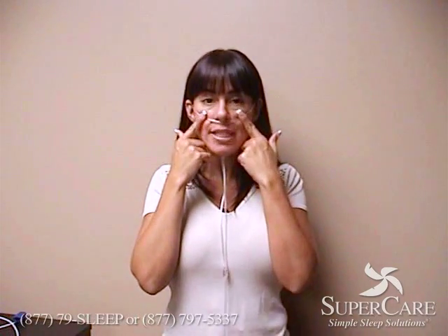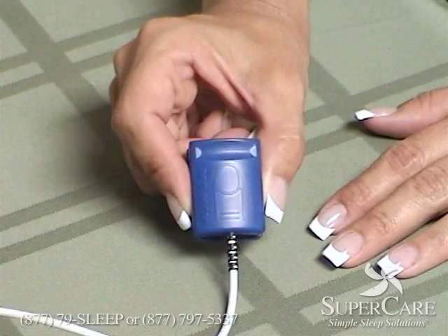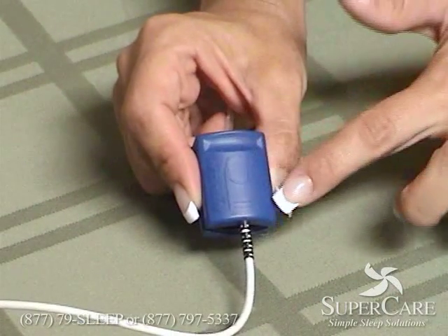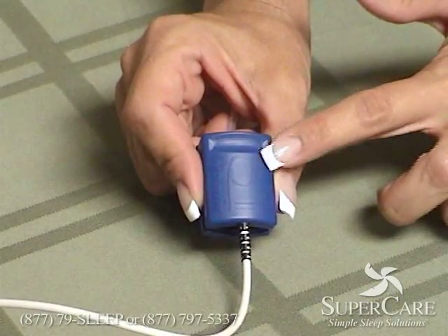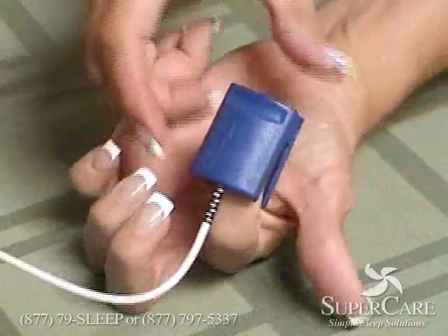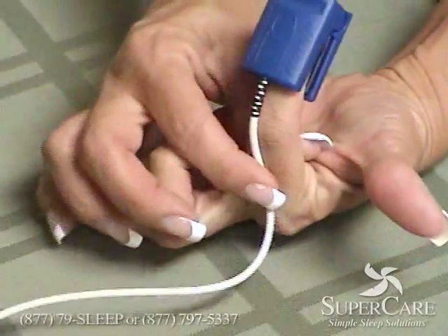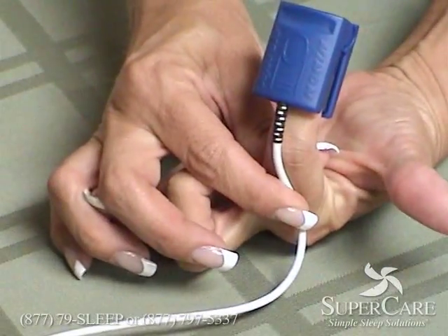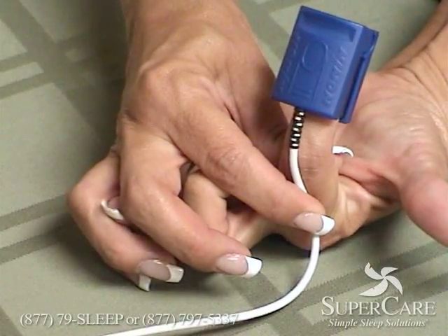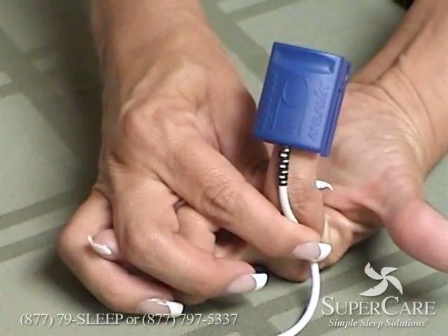At this time you can go ahead and place a couple pieces of tape right here on either side to make sure it stays on and you're ready to put on your finger probe. It has an embossed picture of a fingernail on the top end so when you put it on it will look like you have a fake blue nail. You can use a piece of tape or a band aid to make sure that it stays on during the night. And if you are wearing nail polish, please remove the polish from the finger that you're going to use for the probe.